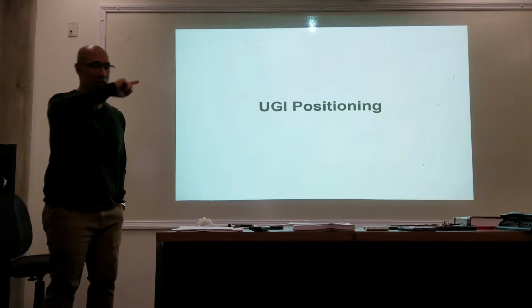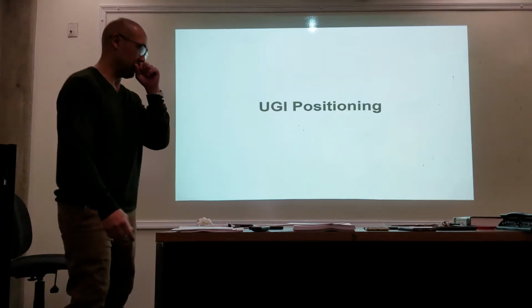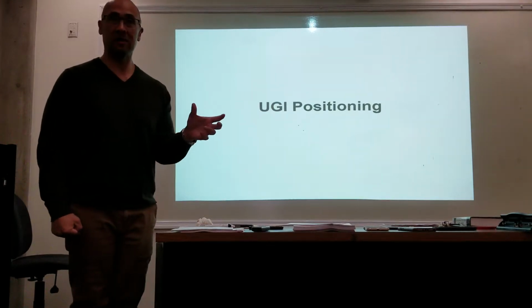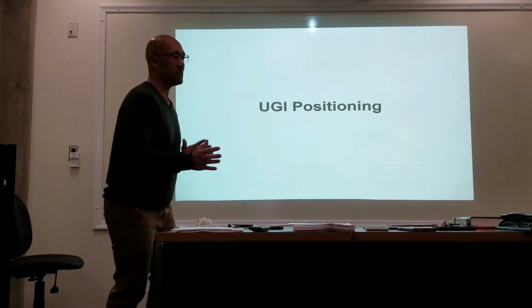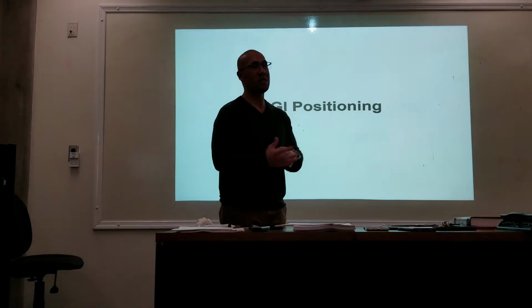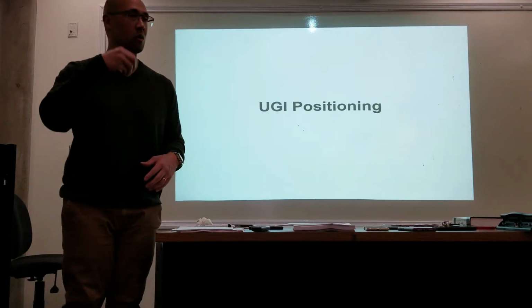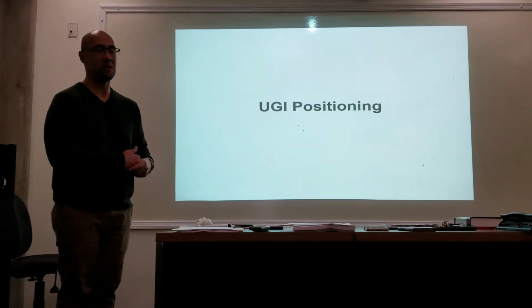Now that you've rotated and coated the stomach, you call your doctor: we're ready for you in upper GI, room 3. They'll do the fluoroscopic study. They may have the patient drink some more contrast during the procedure. Your responsibility while the patient is moving around is to make sure that they don't get tangled up in anything, and to get whatever the doctor wants, more contrast, towels, whatever. Just be ready to assist them.